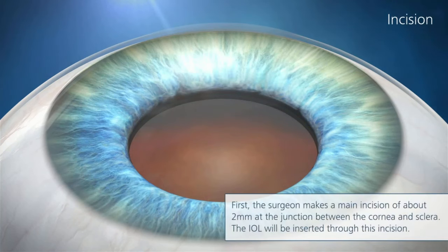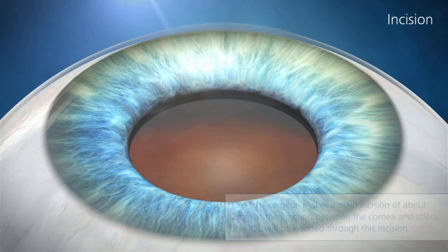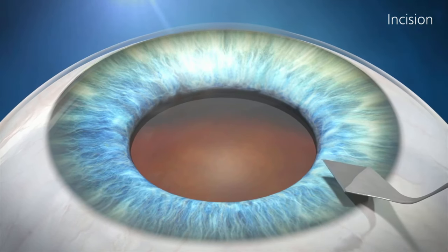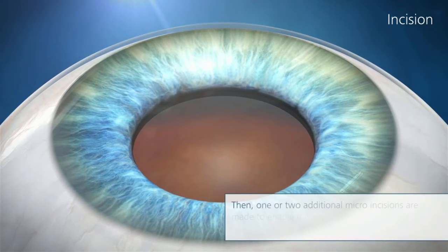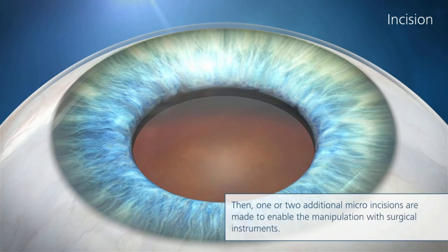First, the surgeon makes a main incision of about 2 mm at the junction between the cornea and sclera. The intraocular lens will be inserted through this incision. Then 1 or 2 additional micro-incisions are made to enable the manipulation with surgical instruments.